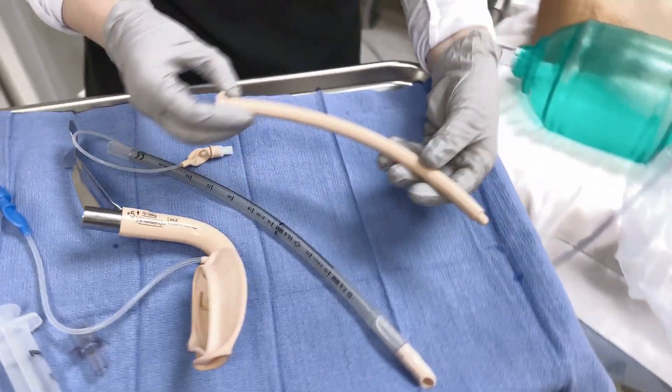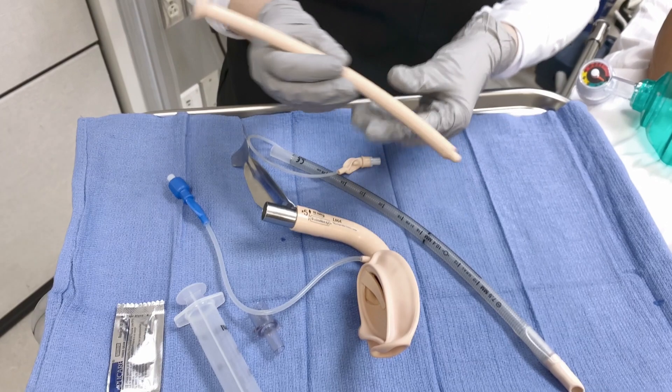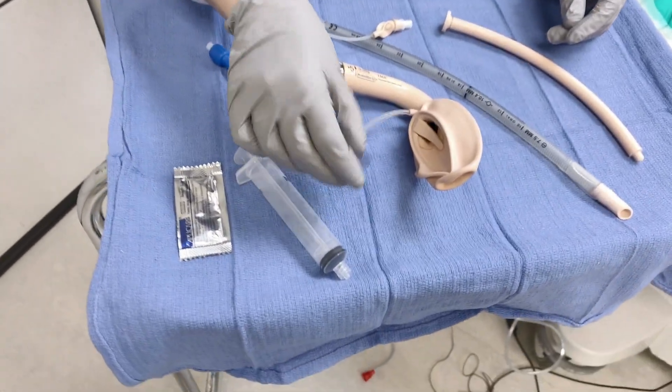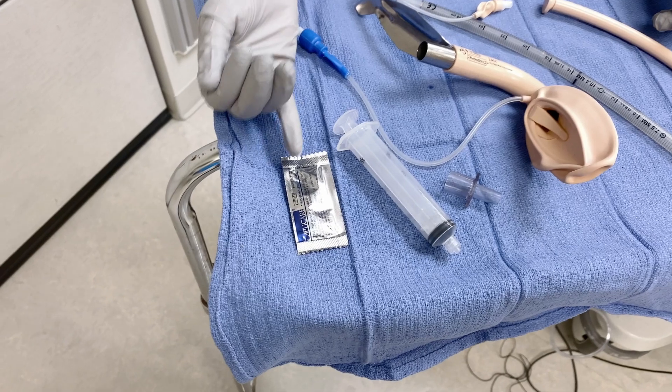You also have the stabilizing rod, which is important for holding the ET tube in place while removing the LMA after successful intubation. You'll also need a connector device for the BVM, as well as a 20cc syringe and some lubricating jelly.